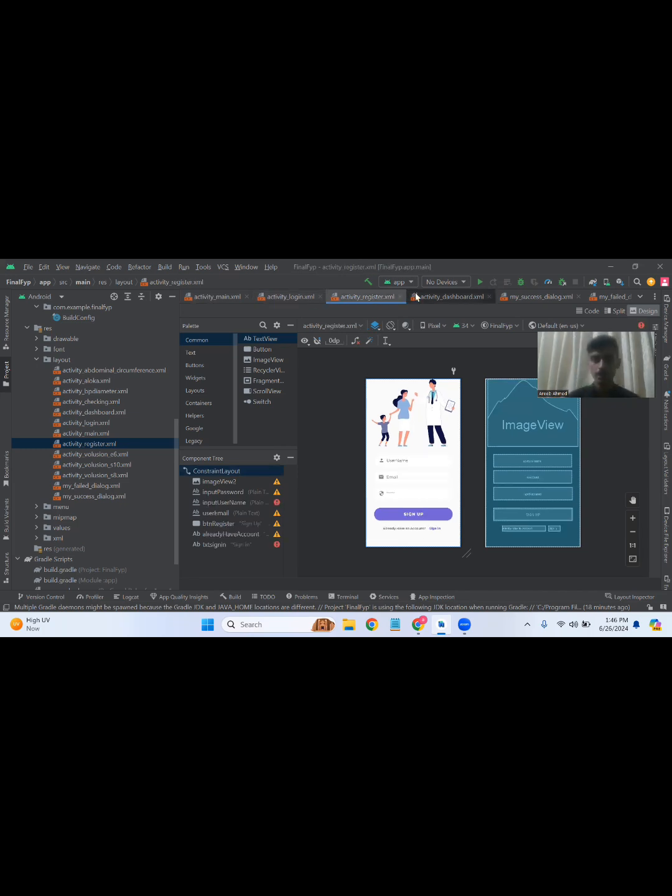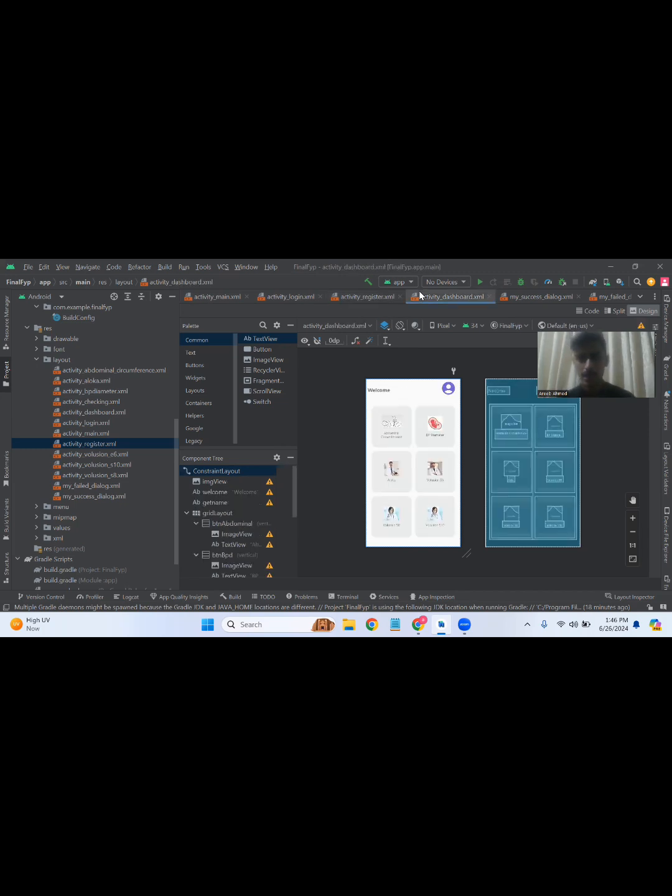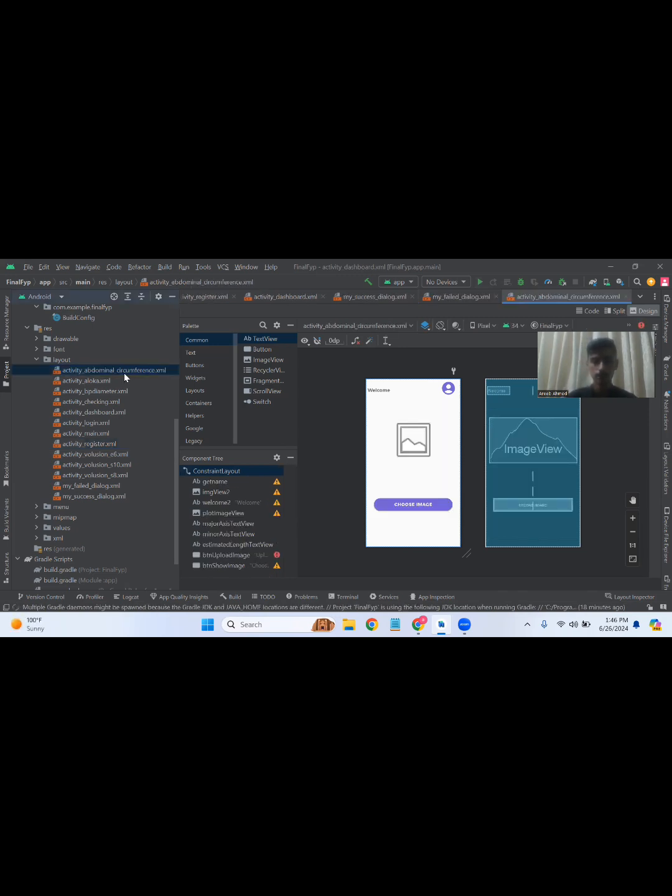After that, we will move on to our main dashboard, from where we can select the parameter that we have to work on, or upload our image for that parameter. As you can see, there are many parameters: abdominal, BPD, Aloka, and many others. If we select abdominal, for example, we move to this screen. Here we can choose our image for abdominal circumference, and from there we can upload our image, which will go to our API and fetch our details.